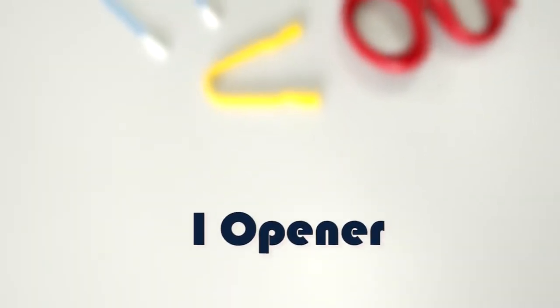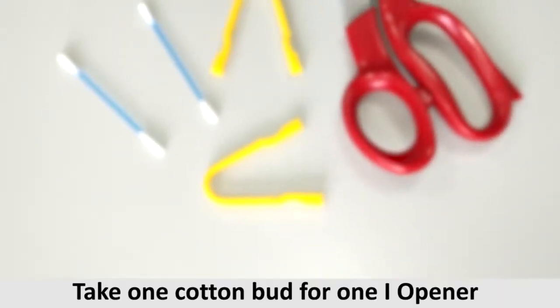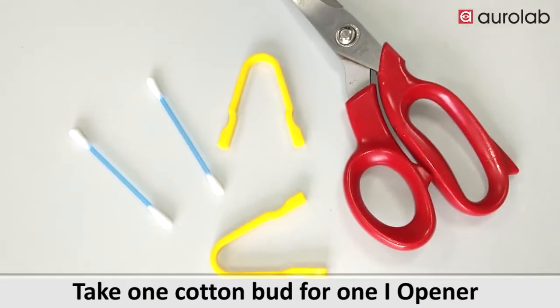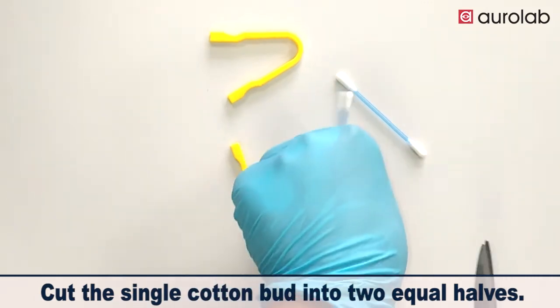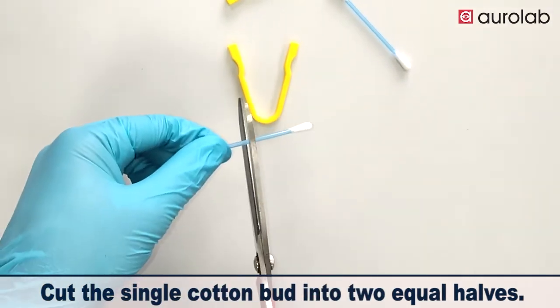Eye Opener. Take one cotton bud for one eye opener. Cut the single cotton bud into two equal halves.